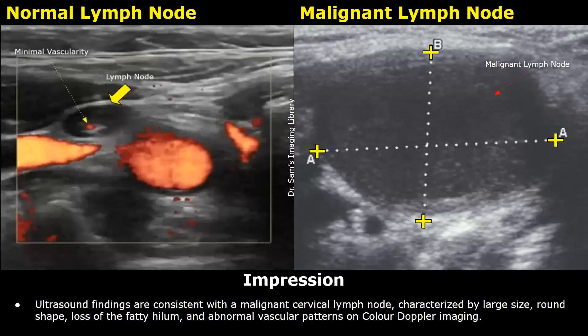The impression: ultrasound findings are consistent with a malignant cervical lymph node, characterized by large size, round shape, loss of fatty hilum, and abnormal vascular patterns on color Doppler imaging.